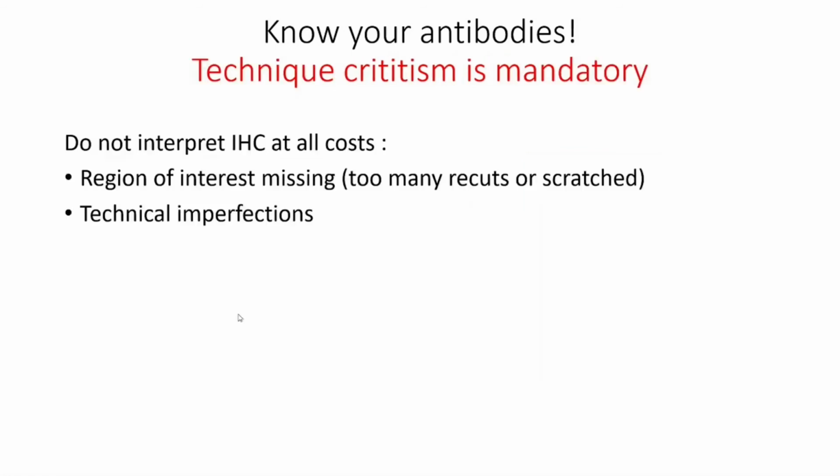And lastly, you need to be critical about your technique, and you do not want to interpret your IHC at all costs. So sometimes the region of interest is missing because there have been too many recuts, or it has been scratched by the technician according to Murphy's Law. Also, there can be some technical imperfections.